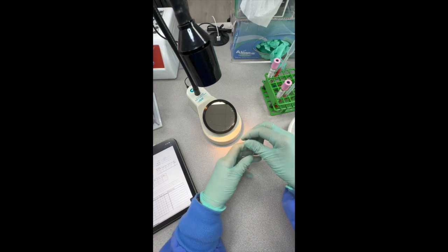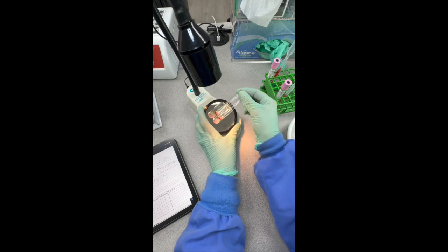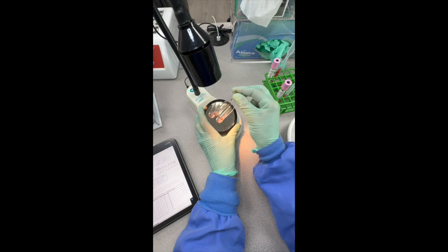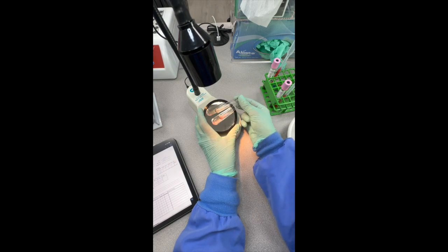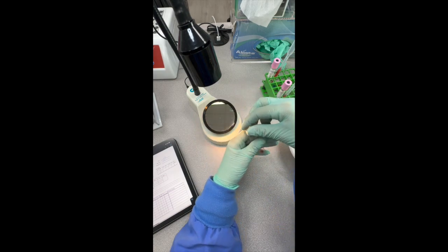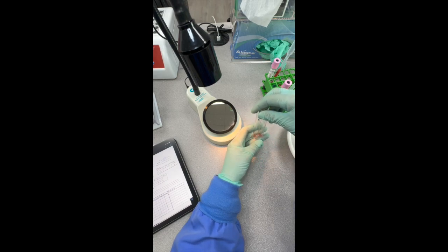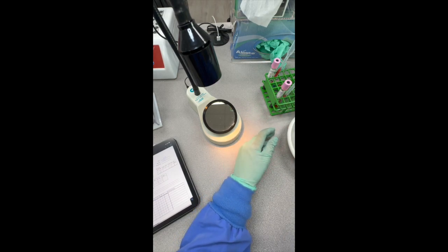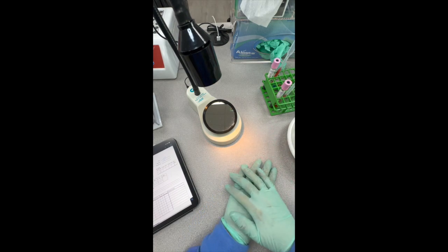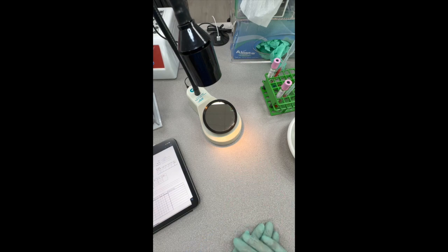Here's our other one. Here's our patient C. We're going to shake and tilt and shake and tilt. And again, those cells are just streaming right off of there. Those are nice negative reactions. Shake and tilt. Looks really good. All right, next step. So we incubated at 37, and now we wash and do our AHG. So I'm going to go ahead and put those into my cell washer, and we'll come back and add AHG.